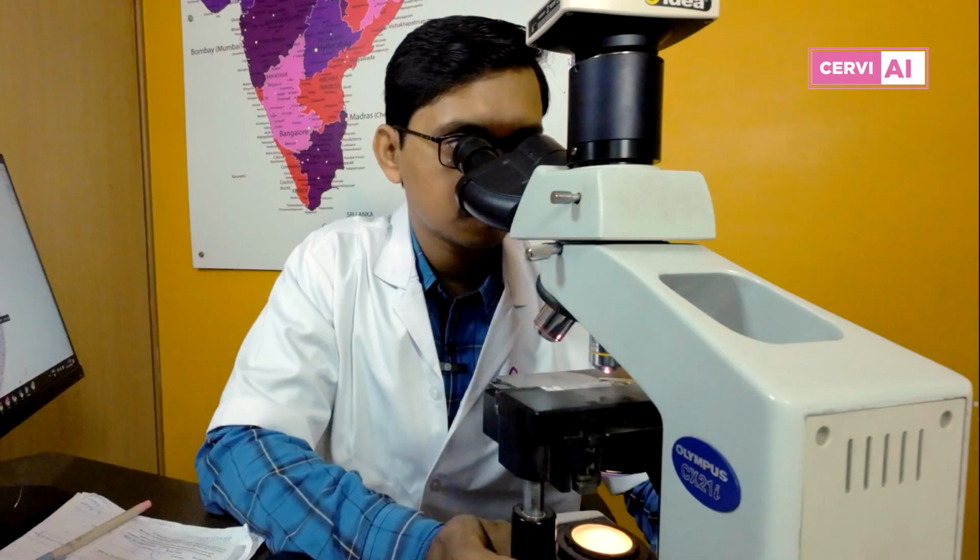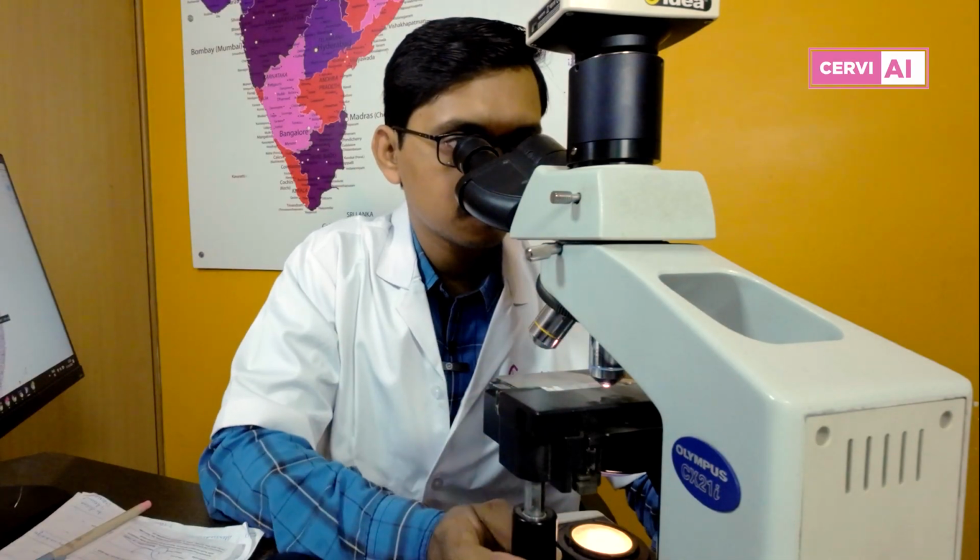Subsequently, based on whatever it has picked, we will be going through the glass slide again, and it helps us to identify them much more quickly. If a potential abnormality is there, it will help us to identify specifically that these are potentially present because I've seen them in the screening, and I'll come to a conclusion on the glass slide and finally sign out a report. It takes relatively much shorter time than the existing method.